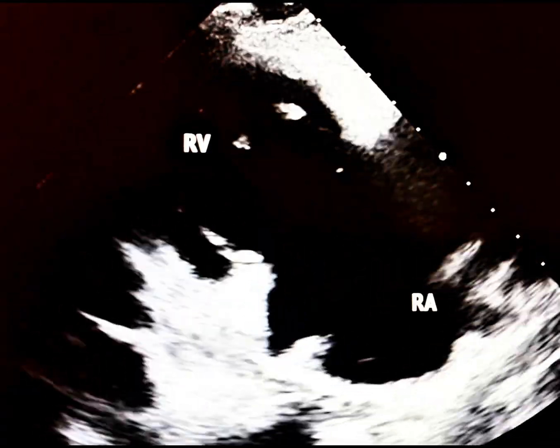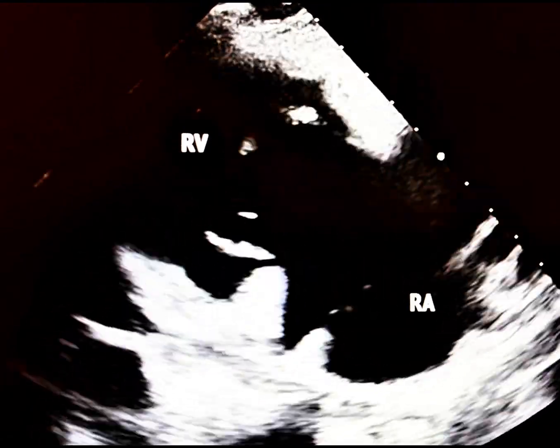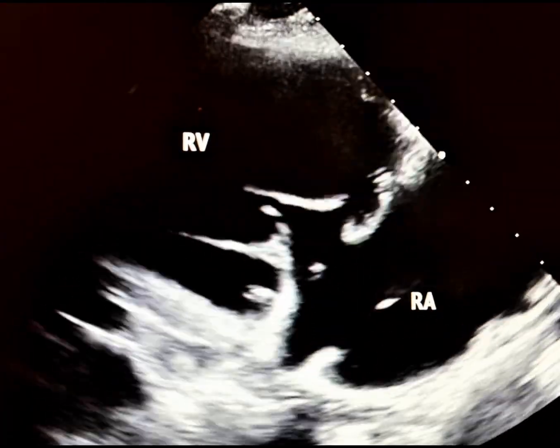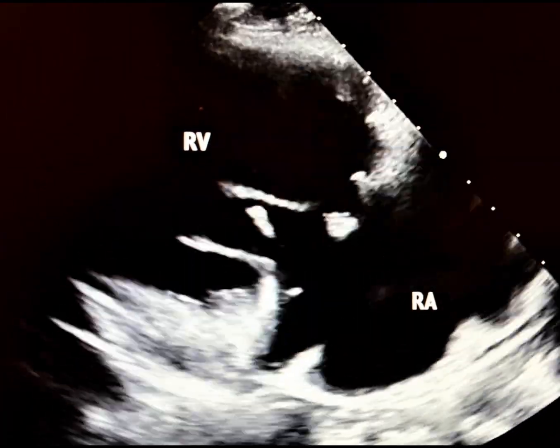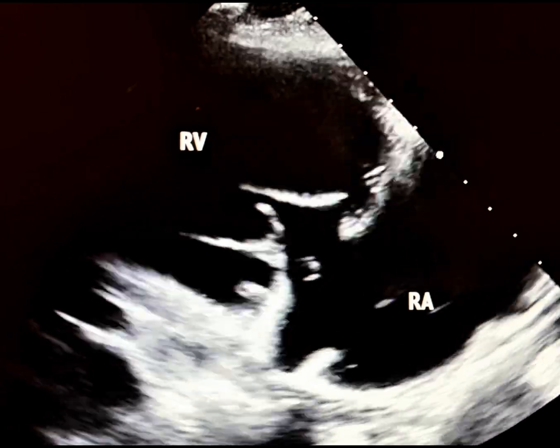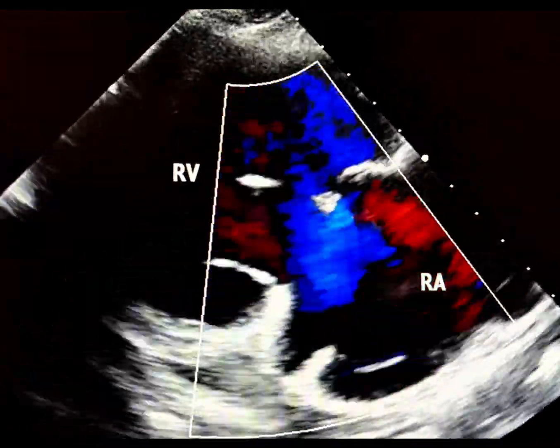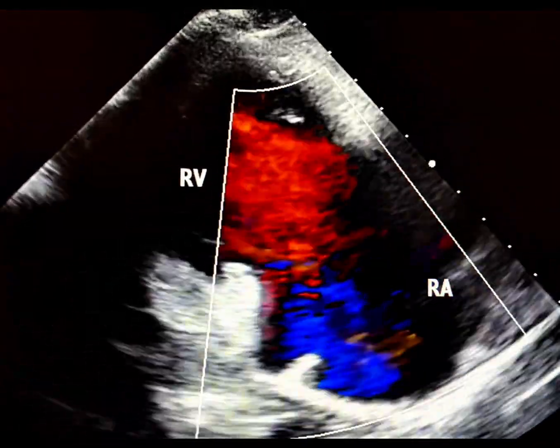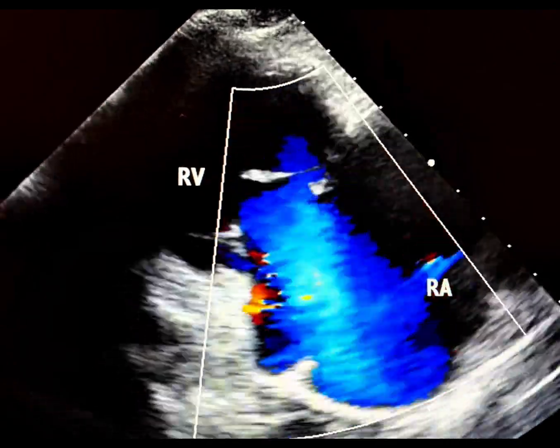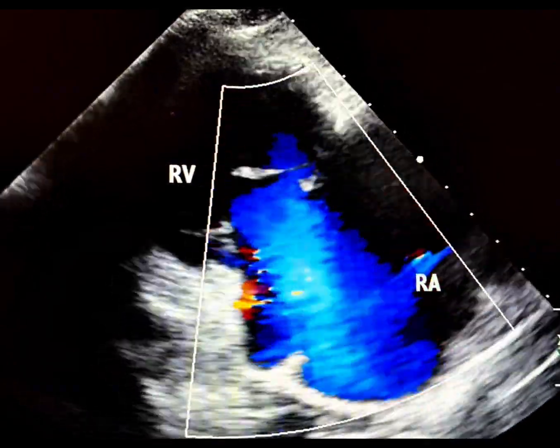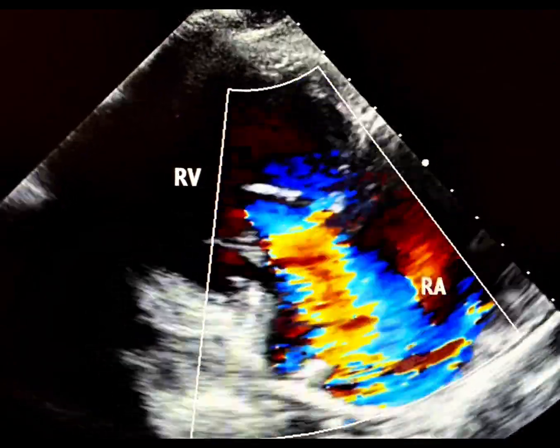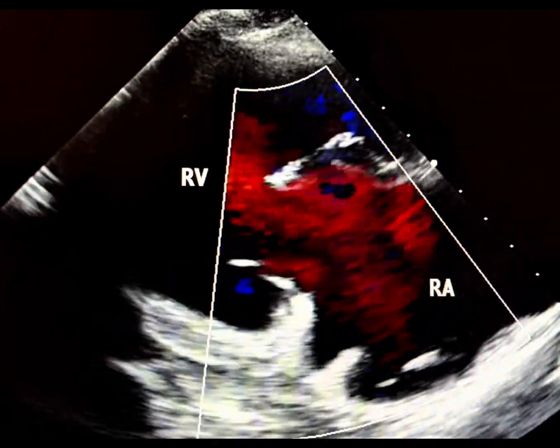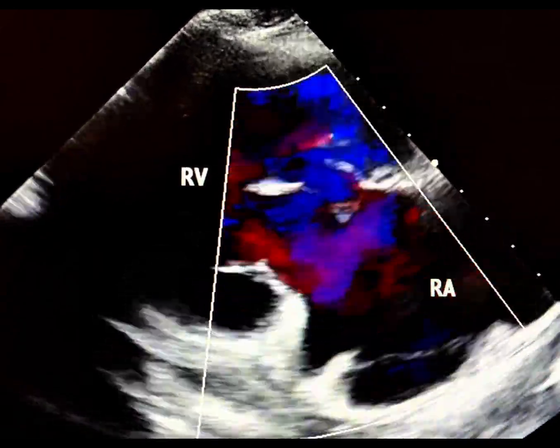This RV inflow view reveals significant tricuspid valve disease. Severe tricuspid regurgitation (TR) in a patient without other cardiac abnormalities may suggest infective endocarditis.